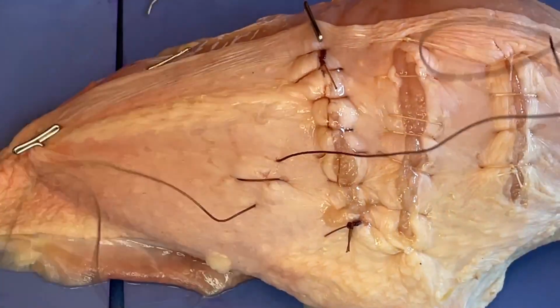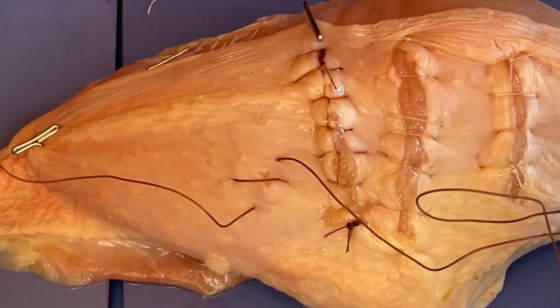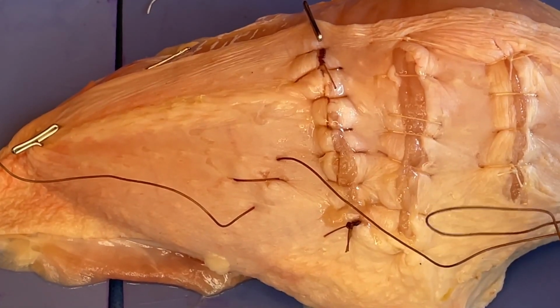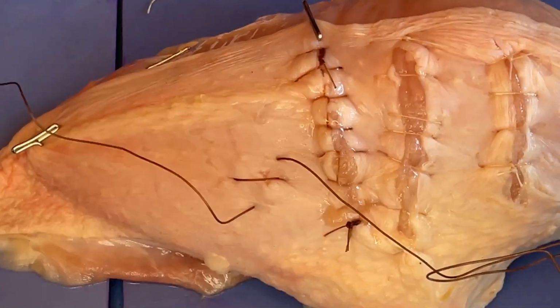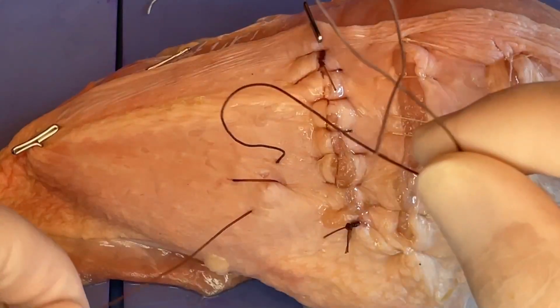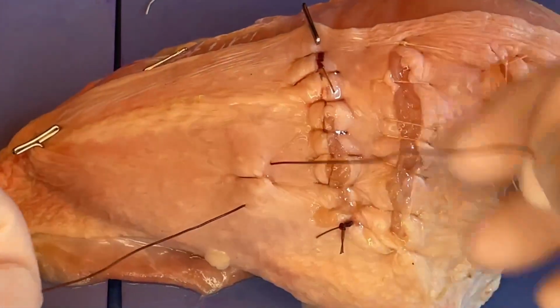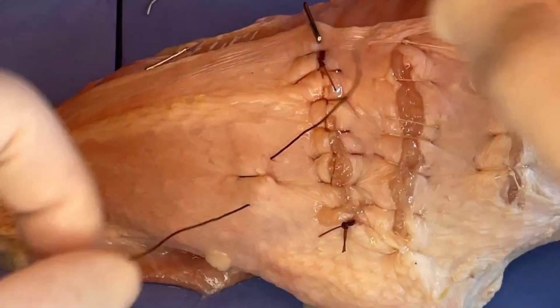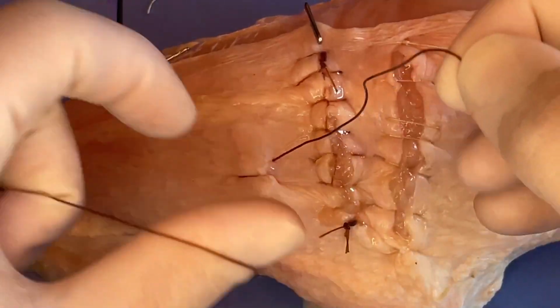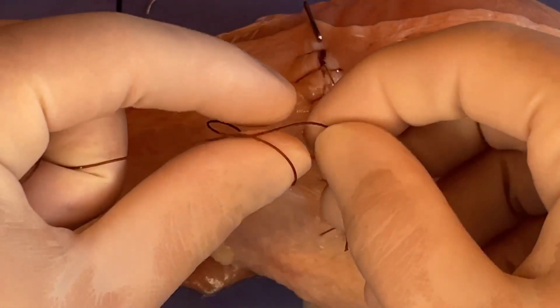So again, for me, I've got the needle here on the left in my needle driver. So I set that to the side, keep that covered up and protected. I've got my free end here in the right. I'm going to pull that through just a little bit more. And so again, what I do is I don't cross strands in this scenario, but just come over thumb, make that loop, swing it through.